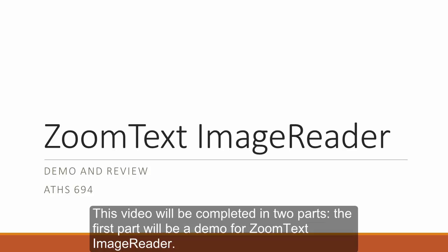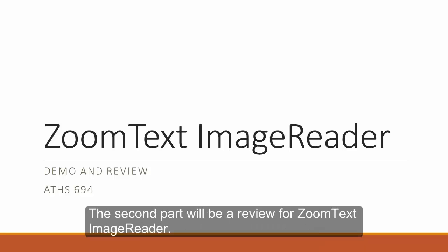This video will be completed in two parts. The first part will be a demo for Zoom Text Image Reader. The second part will be a review for Zoom Text Image Reader.